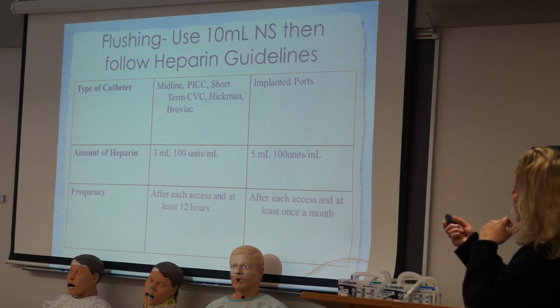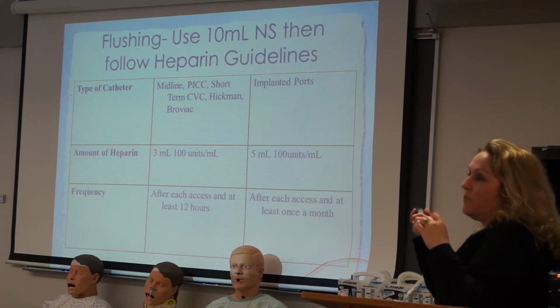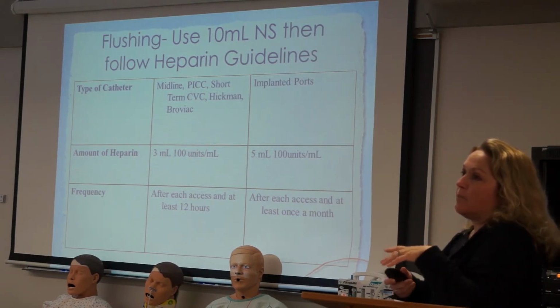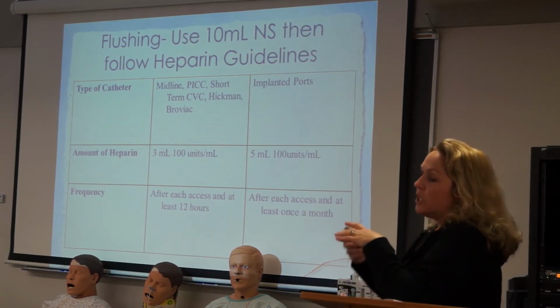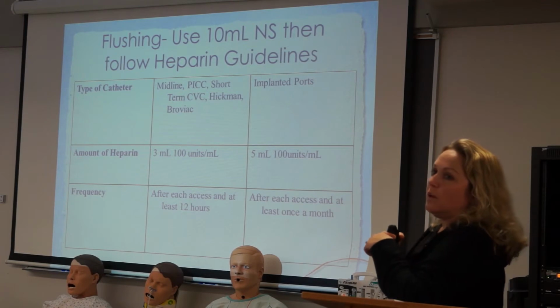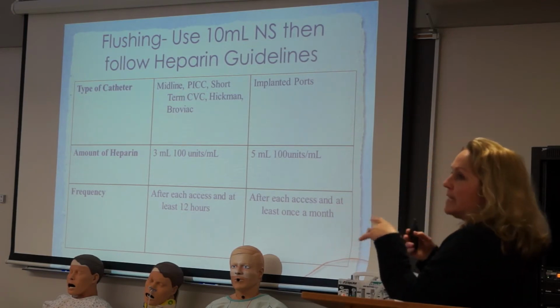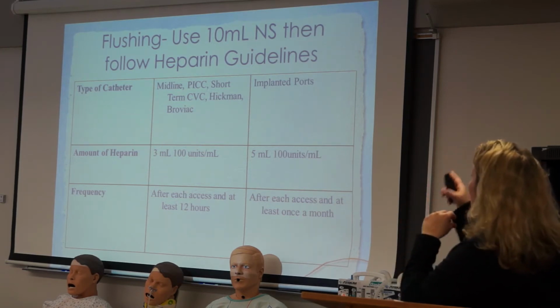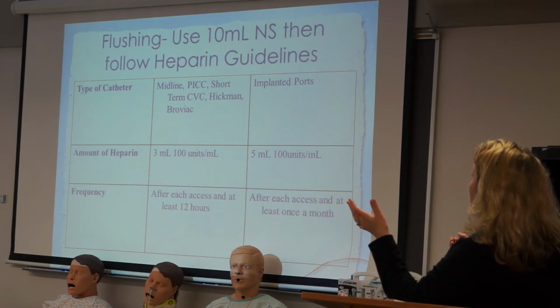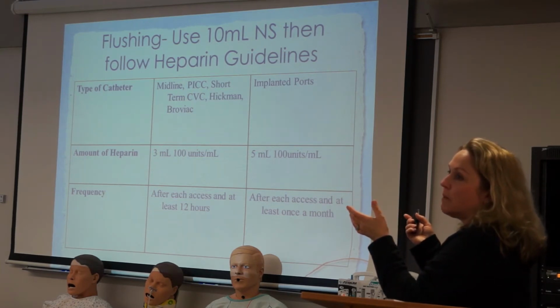And then for frequency of flushing with heparin, after each time you access it, if it's locked, meaning there's nothing infusing. If you access the port to give some medication and you're hooking it back up to normal saline or D5W or whatever, then you don't have to heparinize it because you've got it infusing. And ports, if they're infusing, you don't have to heparinize them. But if they're not, a lot of these patients will have chemo treatments once a month.